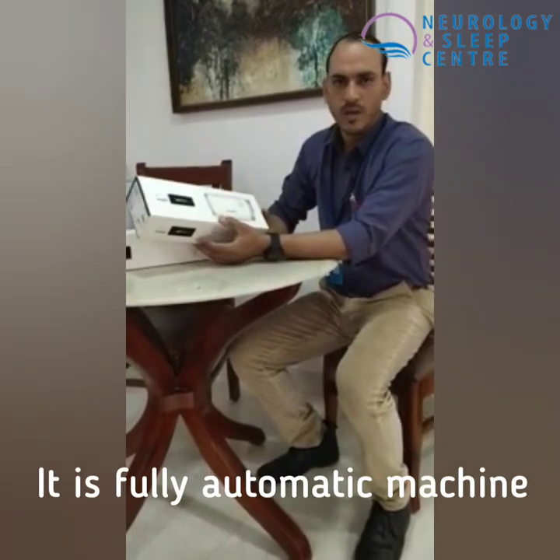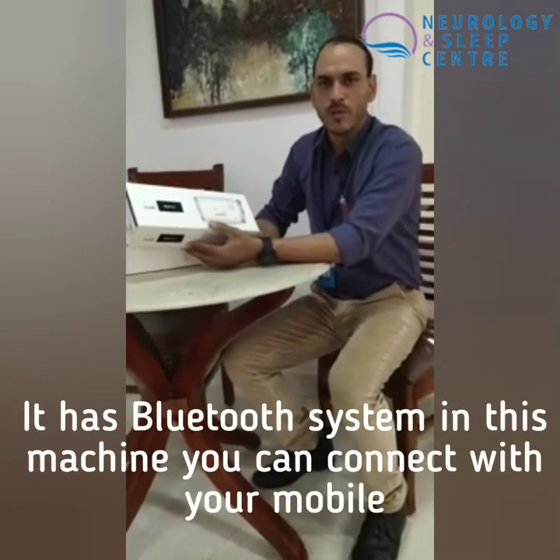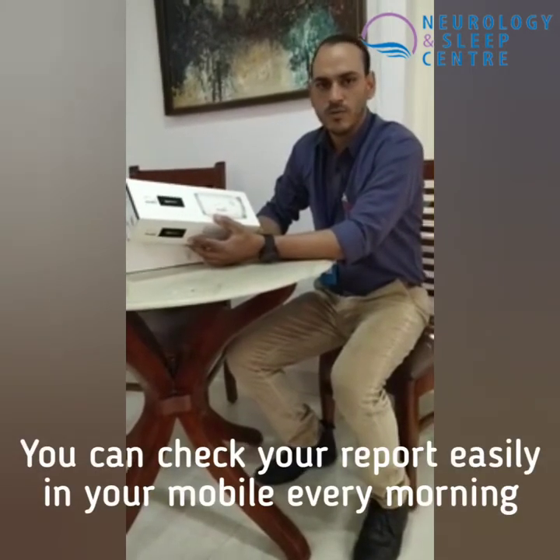It is fully automatic. It has a Bluetooth system and it can be connected to your mobile. You can also view your report from the previous night, and it has a sleep app.